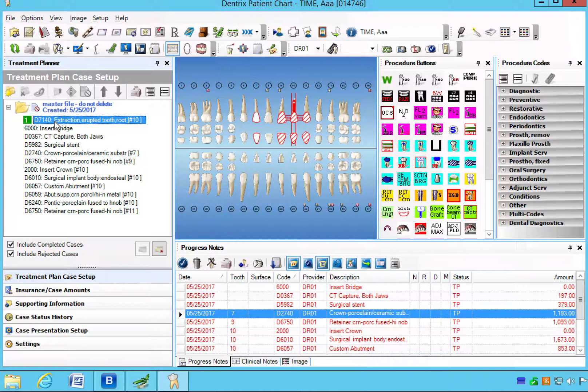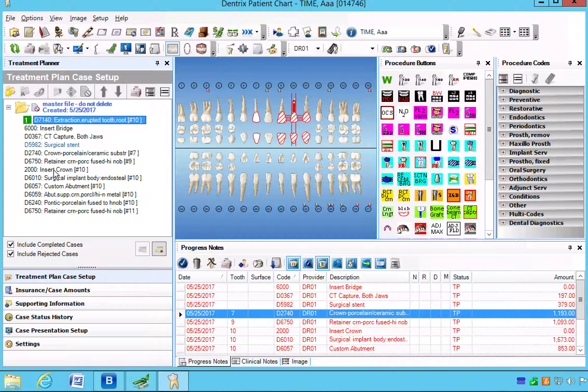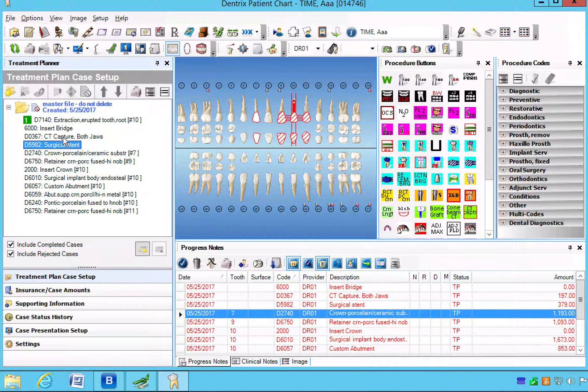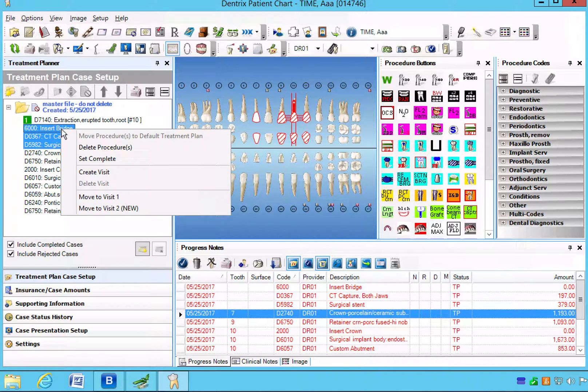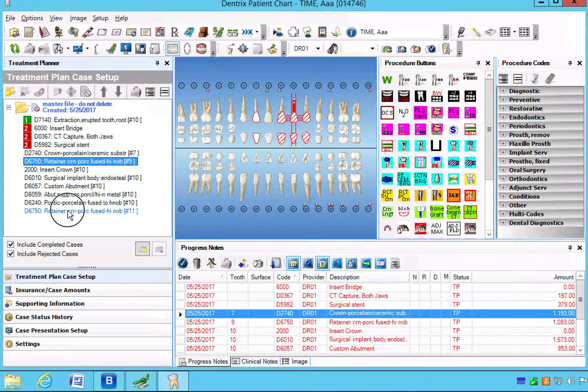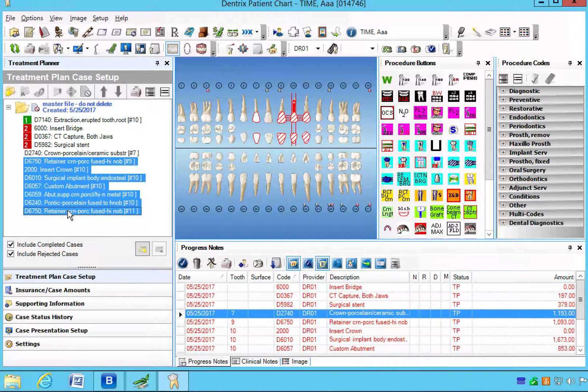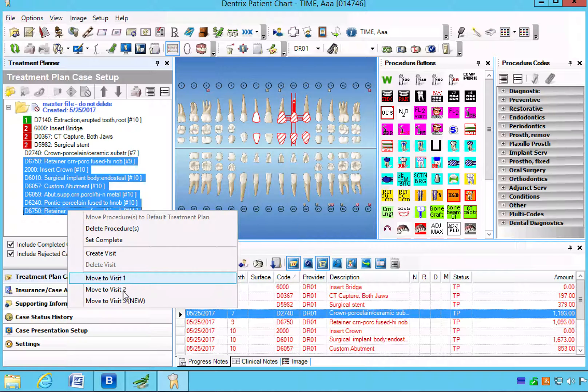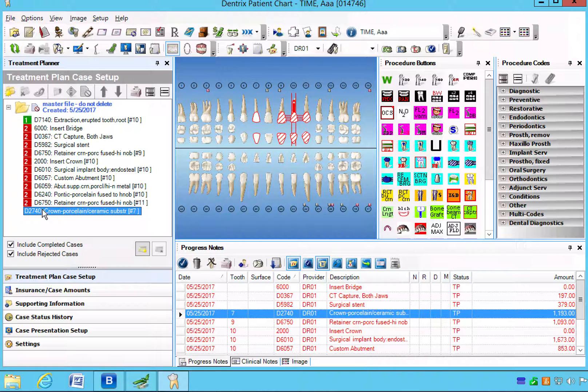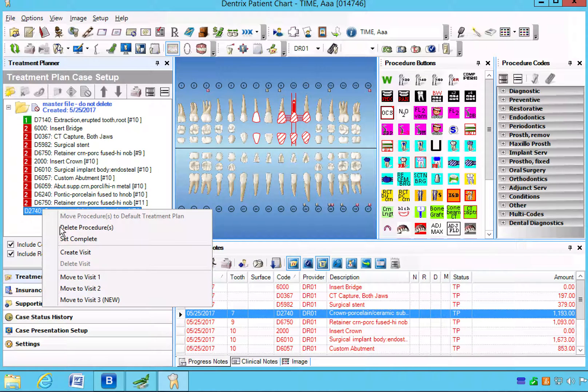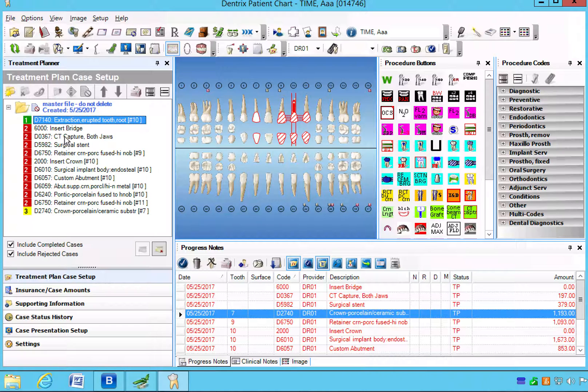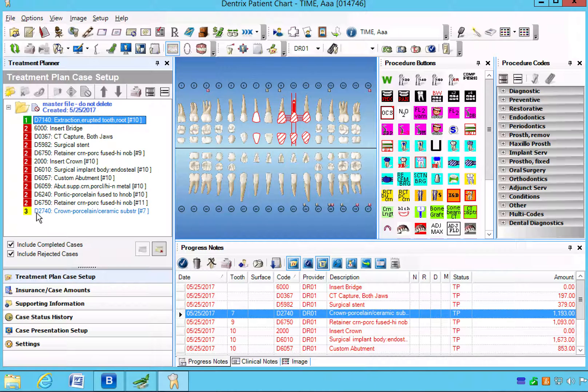Now visit two we're going to do for everything that is not elective, or anything in the middle, which means in this case it's going to include the two alternate options. So we know that the elective is tooth number seven, so we're going to click everything except for tooth number seven, move that to visit two. Move the rest down to visit two, and then we will put the crown down to visit three. There we go: mandatory, optional alternatives, and elective treatment.